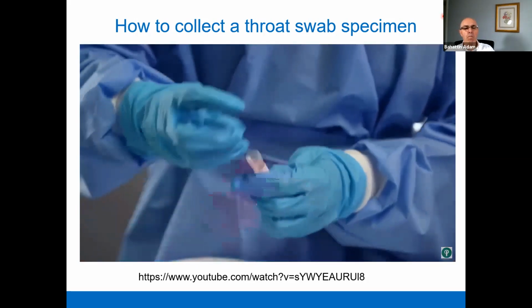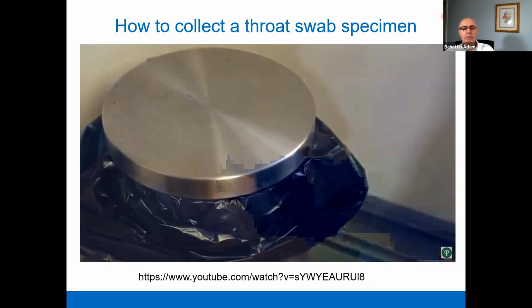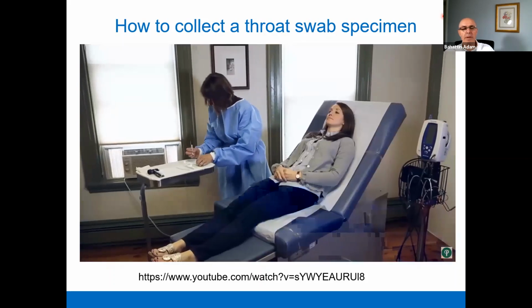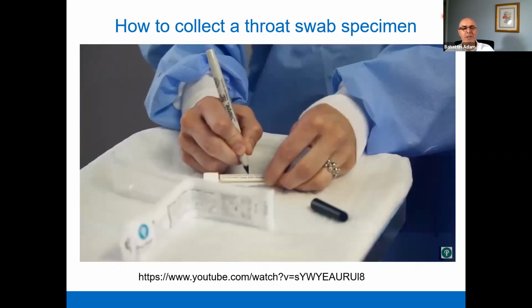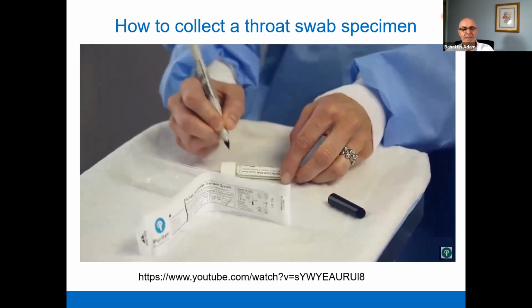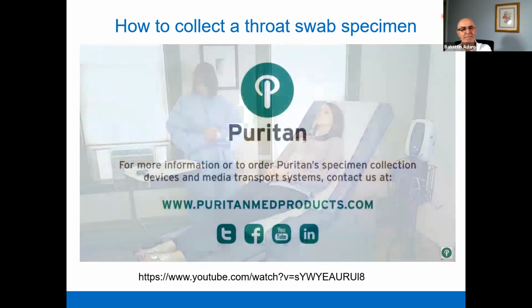Break the swab handle at the scored breakpoint line. Replace the cap and tighten to secure. Remove and dispose of gloves and mask properly. Label the vial with appropriate patient information. Throat swab specimen: deliver samples to the laboratory for testing.